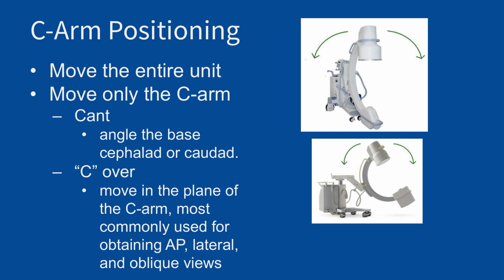Again, if you're operating one of the smaller units, you may be able to do this yourself, but very often with these larger units, you need to have an assistant, typically that's going to be your radiologic technologist.